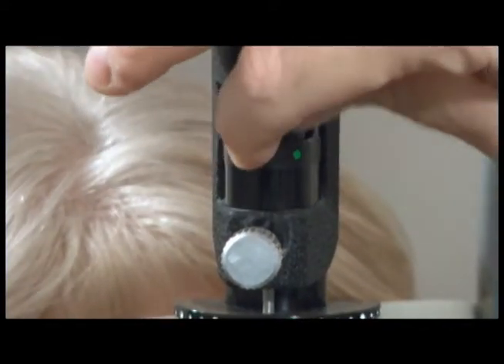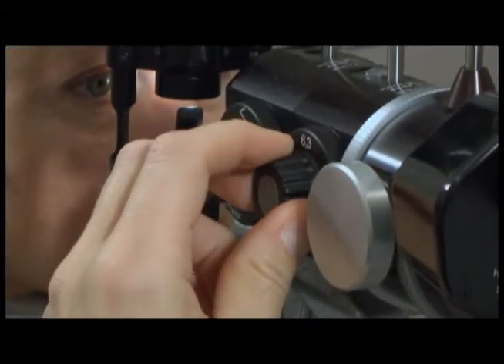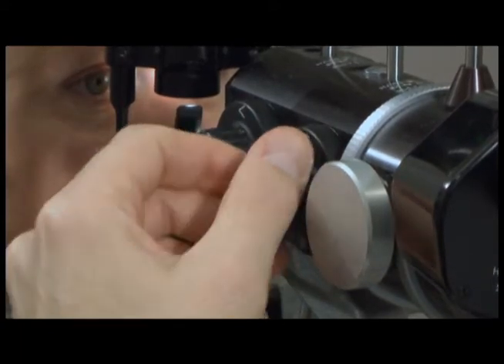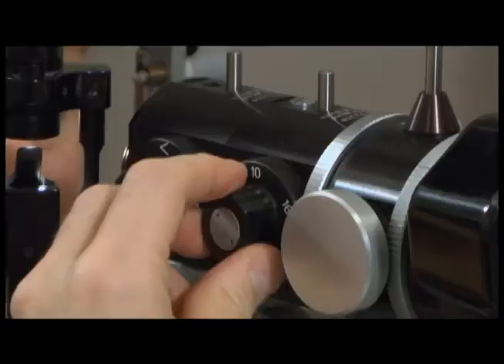The knob on the side with numbers determines the magnification of the image through the oculars. Usually, it is a good idea to start with a relatively low magnification and increase the magnification as needed.